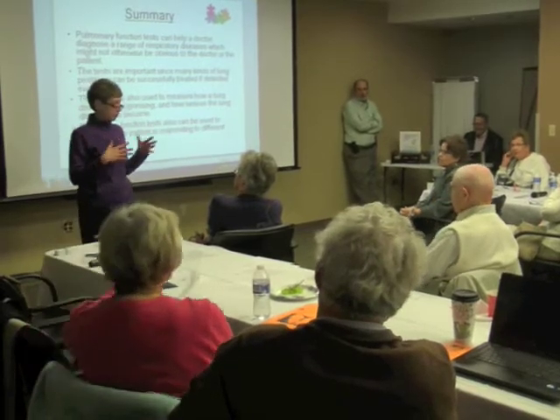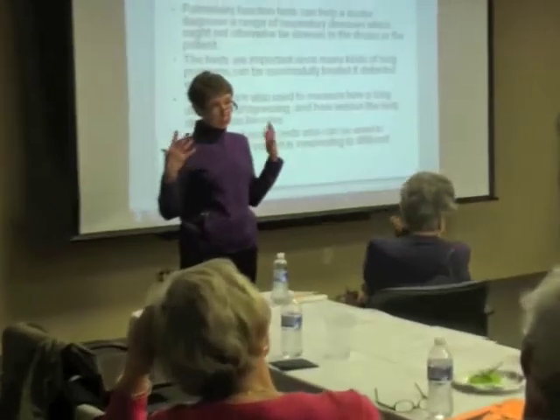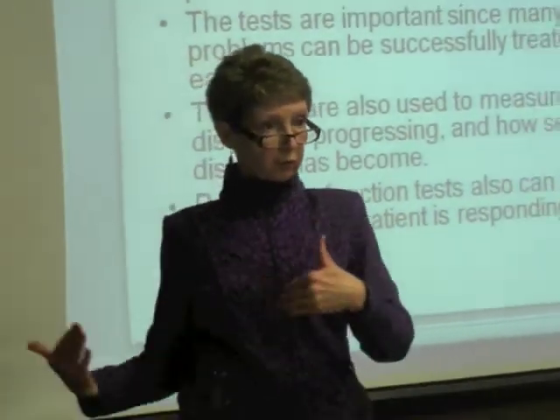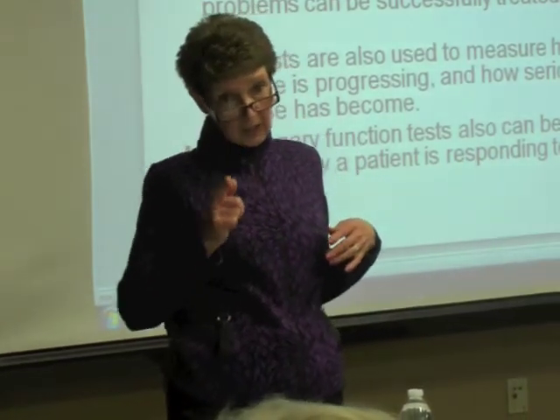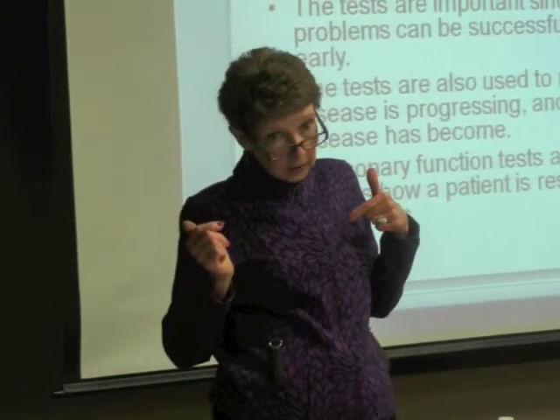We have these machines, but we've got to make sure the machines work. So once a week, and we have 3 of these big boxes, I have to do all of these tests on each one of those 3 machines, and I should essentially get the same number each time I do it. I do try to do that at the same time. I do better in the morning; after I've had my lunch, I don't do as well.